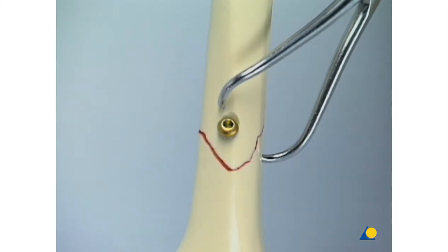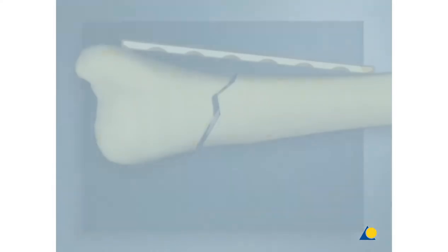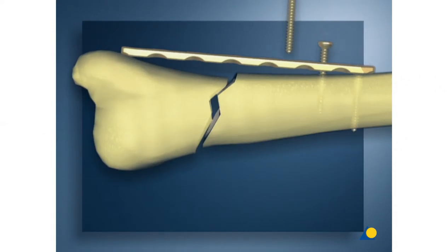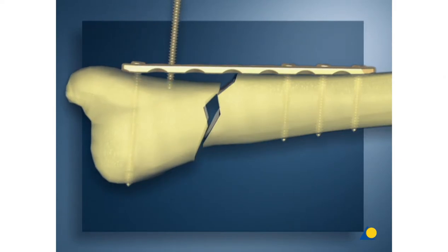A 4.5 millimeter cortex screw is inserted to provide inter-fragmentary compression. The reduction forceps is removed. Here, an inadequately contoured LCP fixed in a conventional way is shown. When the last screws are tightened into the poorly contoured plate, the fracture dislocates.